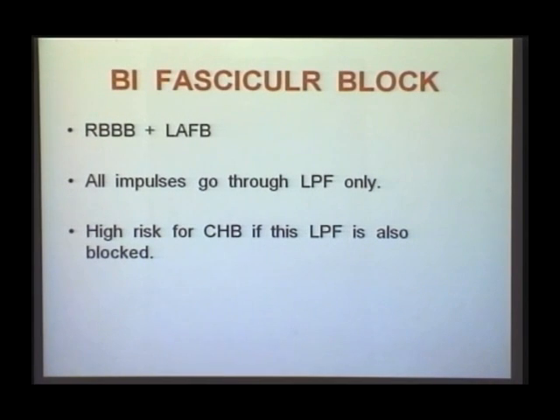A patient comes to you with recurrent syncope. You take an ECG. Whenever there is a syncope, you always expect a bradycardia. Always when there is a bradycardia only, you think the syncope is cardiac. But here the rate may be normal, 70, 75. The patient may have a bifascicular block. He will have an RBBB, and you will have a left anterior fascicular block. This fellow is going for recurrent syncope. You must imagine that intermittently his left posterior fascicle is being blocked. So then we plan for a pacer at this stage itself. So that is the importance of diagnosing an advanced conduction system disorder.